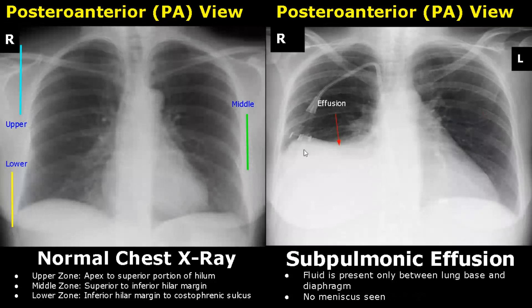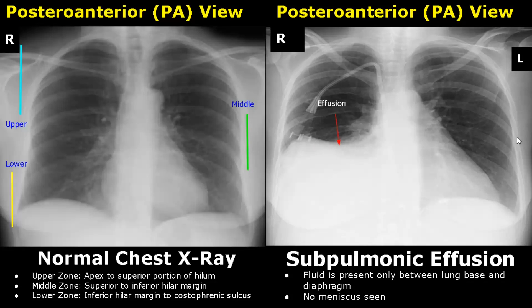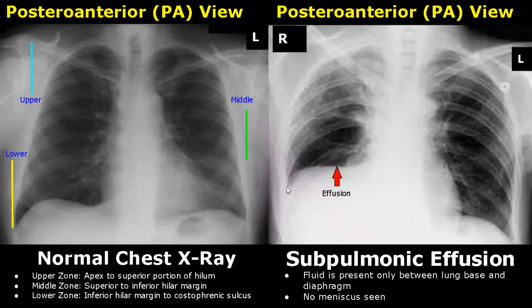Subpulmonic effusion is a type of pleural effusion in which fluid is present only between the lung base and the diaphragm. The meniscus is not found here — there are no concave shaped lines seen. The interface is somewhat dome shaped, just like the diaphragm. This feature helps in distinguishing a subpulmonic effusion from a pleural effusion. Here is another image of a subpulmonic effusion with no meniscus seen. It can be further evaluated in a lateral decubitus view.